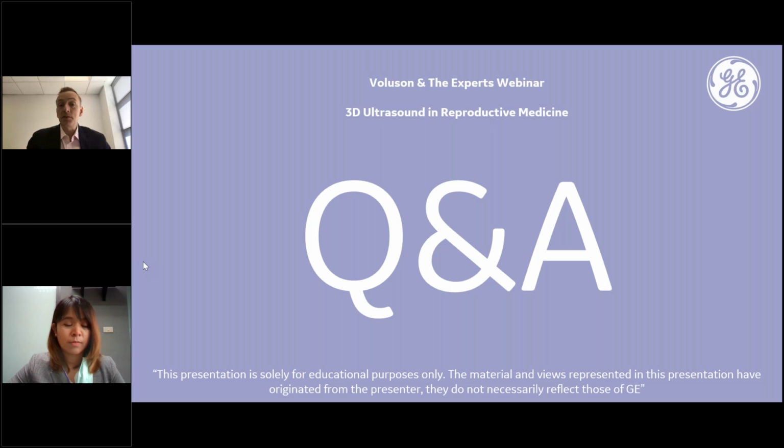I always tell them I'm going to press, and I press gently and move. So you can modify the position of the uterus in many patients. Bladder will also affect it. Sometimes an overfull bladder or filling the bladder may help. It may induce retroversion, and if you're retroverted, sometimes that helps as well. But the key, women who have axial uteruses are often the postmenopausal women, and they're very difficult to scan.